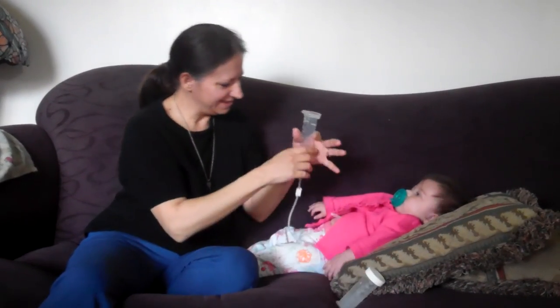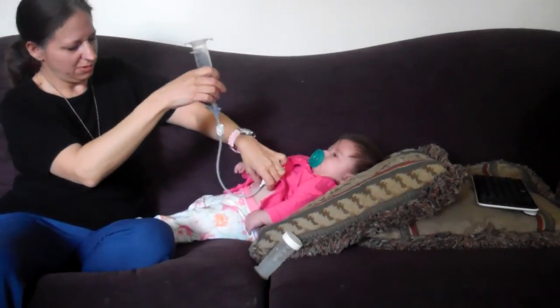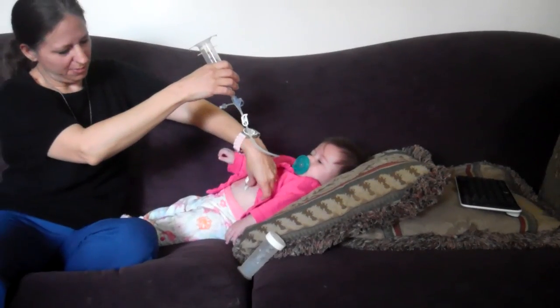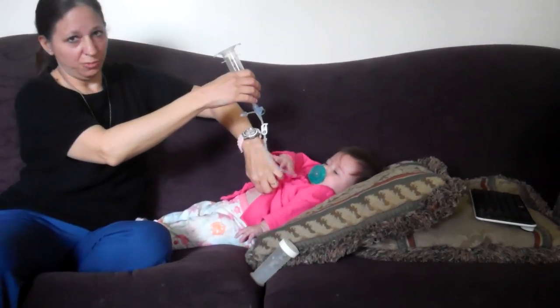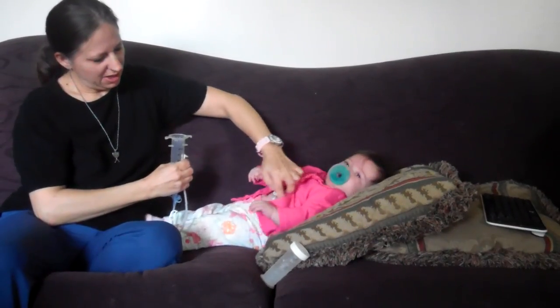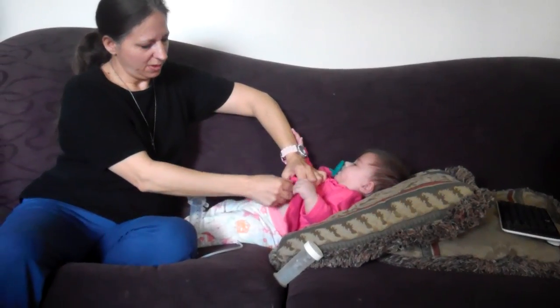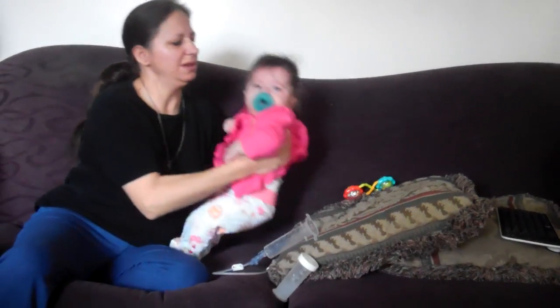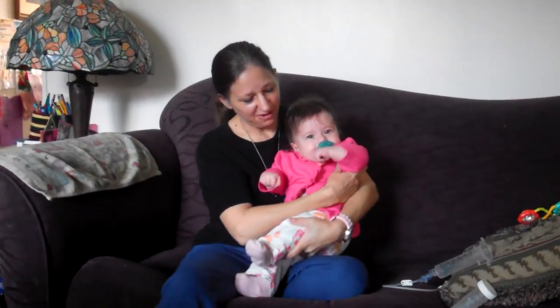All done. And I'm going to take this off. I'm just going to turn it to the left until it lines up with that black button again. The two lines line up together. Remember, when you put it on, you're pushing it in there, but it's not going to hurt her. And then I put this back on. It opens. And you close it. And now Hannah is all done eating. I'll gently lift her. All done. Now she has a full belly and she's all done with her feeding.